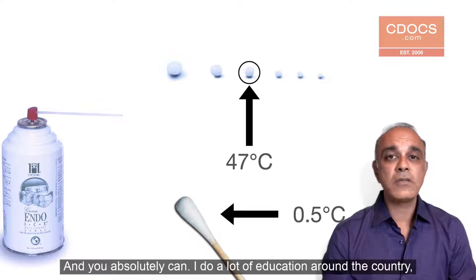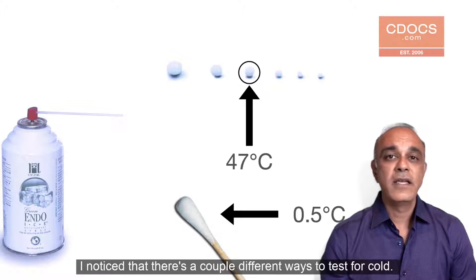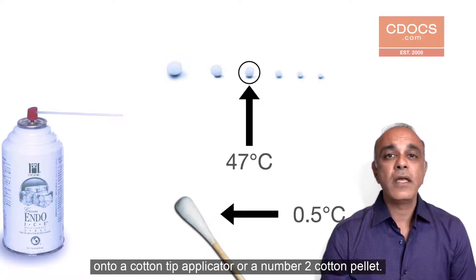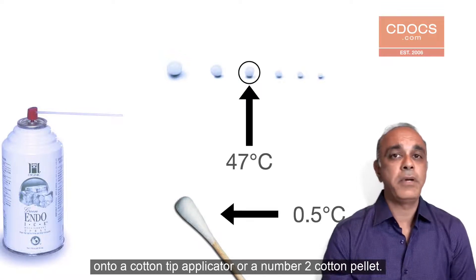And you absolutely can. When I do a lot of education around the country, I notice that there are a couple of different ways to test for cold. You can either test for cold by delivering endo ice or the refrigerant onto a cotton tip applicator or a number two cotton pellet.